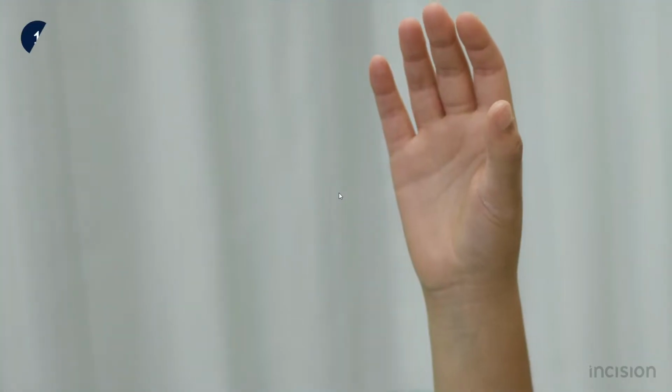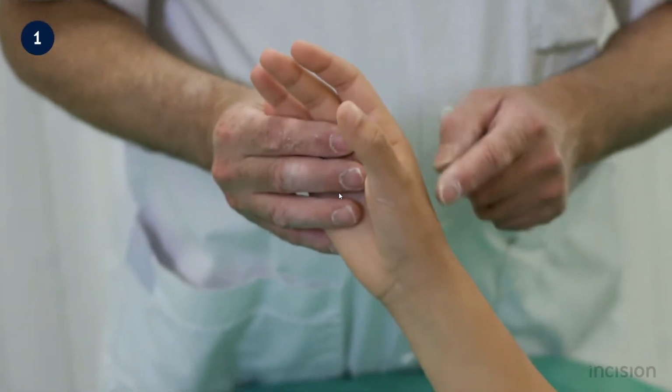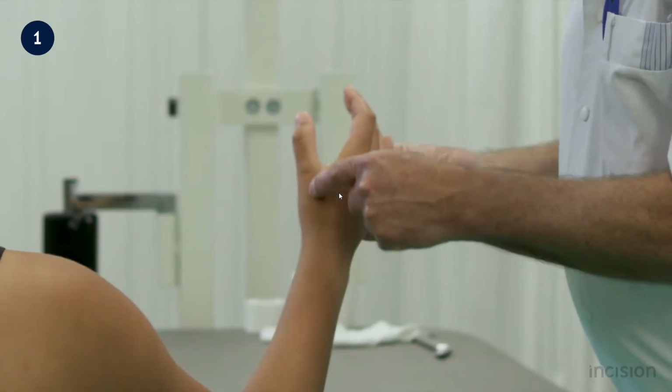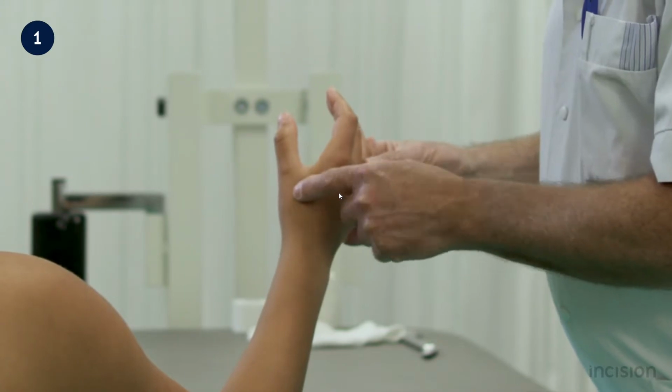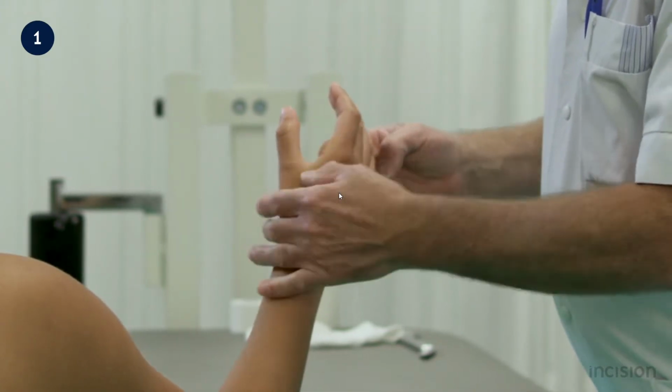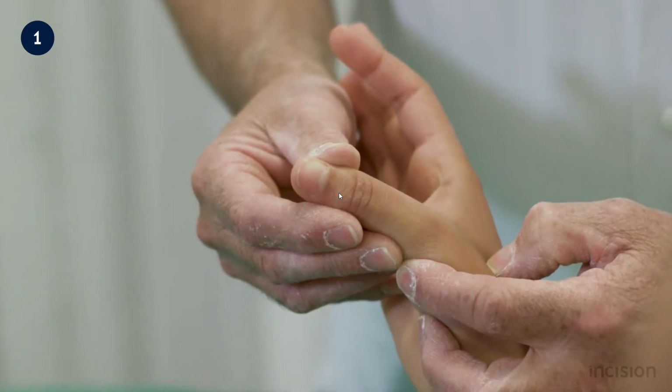In this film, the application of the thumb spica splint is demonstrated. In this case, the patient is presenting with a stable, non-displaced fracture of the first metacarpal bone. Rupture of the ulnar collateral ligament of the thumb may also be an indication for a thumb spica splint.